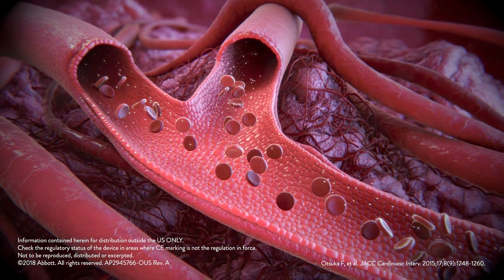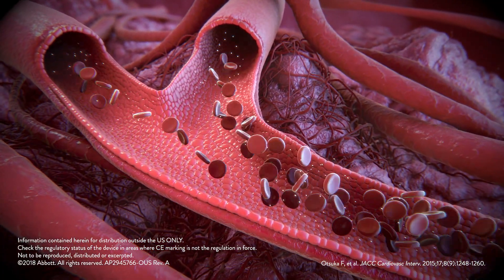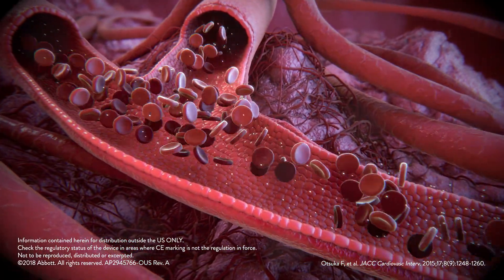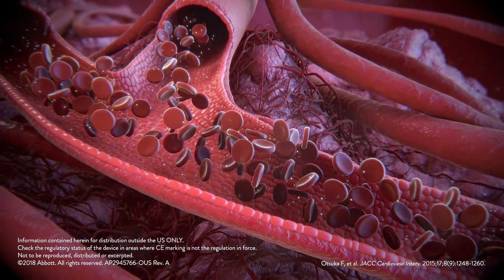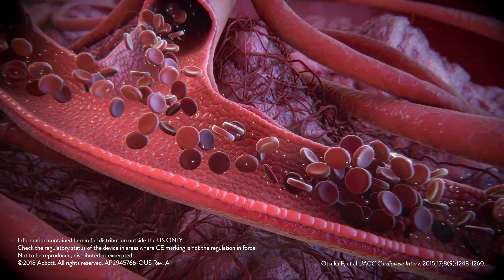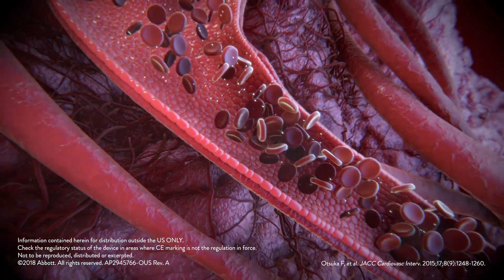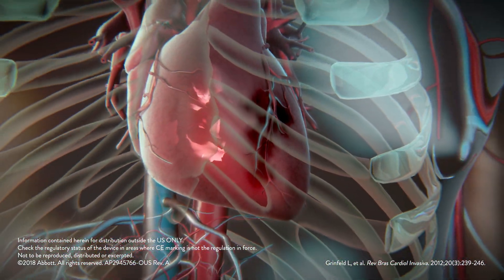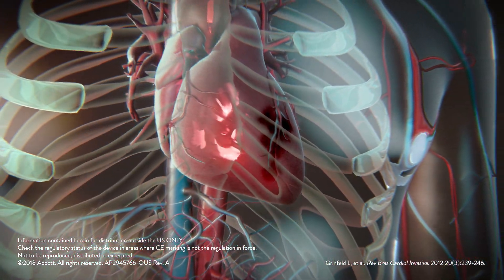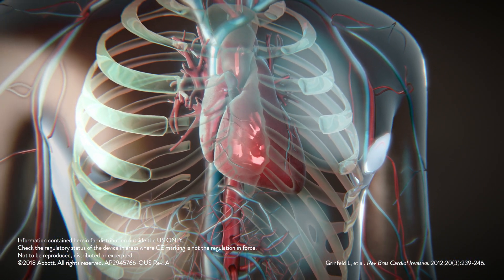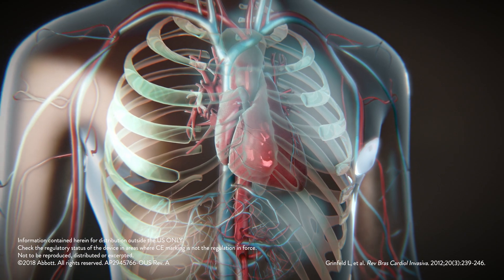Xience is less thrombogenic and causes less acute and chronic inflammation than other durable polymers and bare metal surfaces, which contributes to consistently lower stent thrombosis rates compared to biodegradable polymer and polymer-free stents. The Xience fluoropolymer translates into safe and fast functional healing and excellent outcomes in all patients, including complex patients.